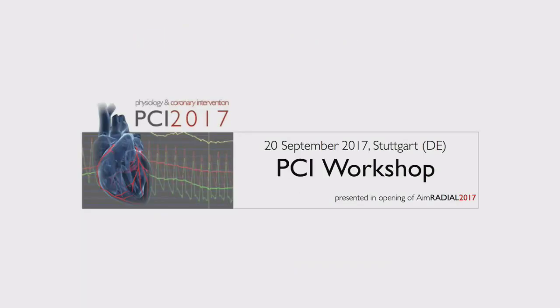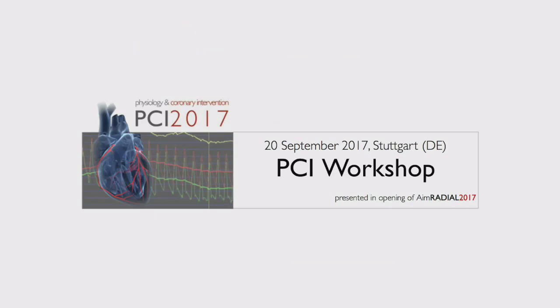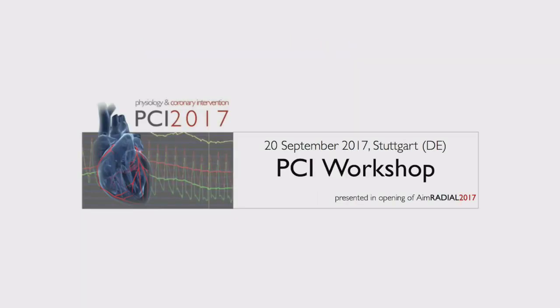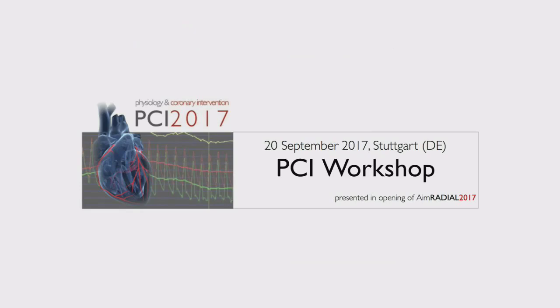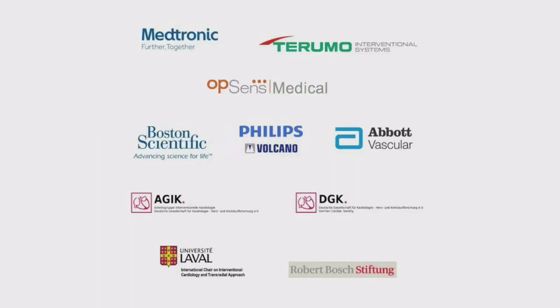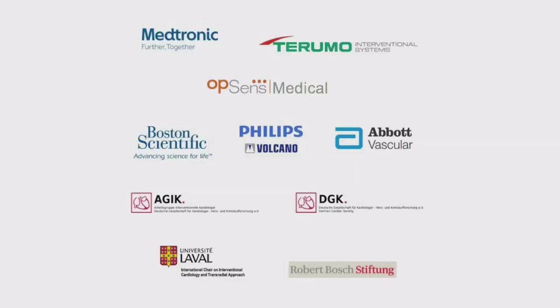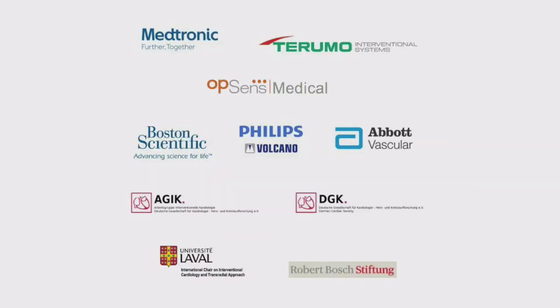And I showed you that slide with Dr. Honda, who did this with IVUS guidance. You simply have worse outcomes if the lesion is longer than 50 millimeters. And then there is the AVIO trial, where they used IVUS in order to optimize PCI technique, and they looked at whether there is any impact on the clinical outcome if you do it with IVUS. They compared with angiography guidance, and what they achieved is just that the minimal luminal diameter is higher, but it does not translate to any clinical outcome. So I'm not sure that if you would redo the same using IVUS, you would get better numbers.